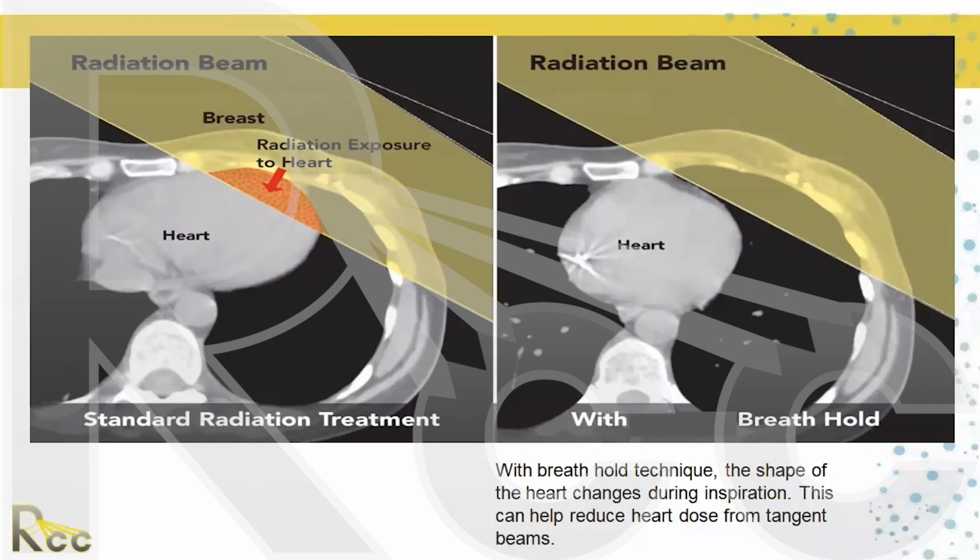there's a short answer, and it's metastatic disease best treated with Cobalt. But then people are going to say, well, that's all I have. What do I treat? And the answer is, well, you can treat anything with Cobalt. You've got to be really careful with the normal surrounding healthy tissue.